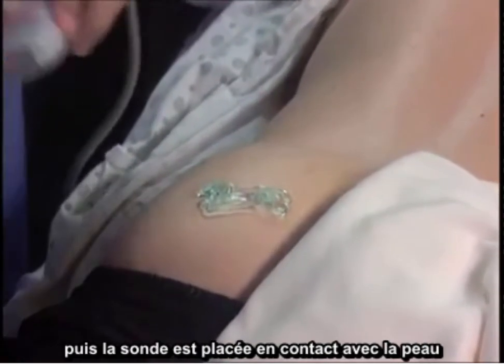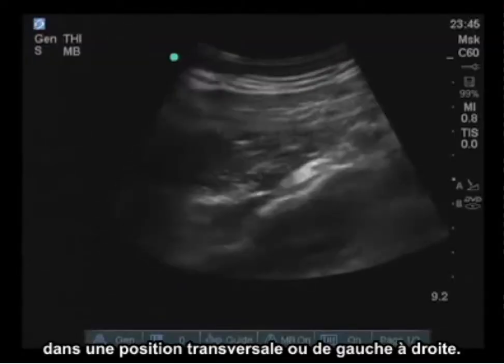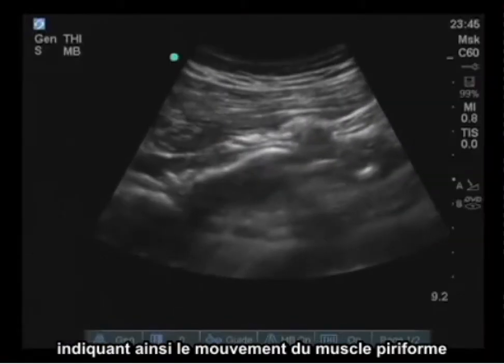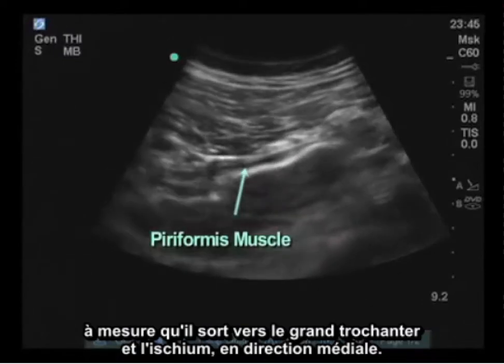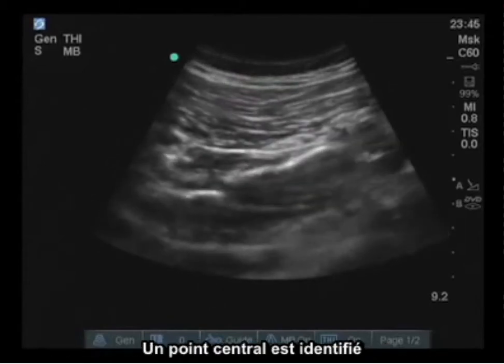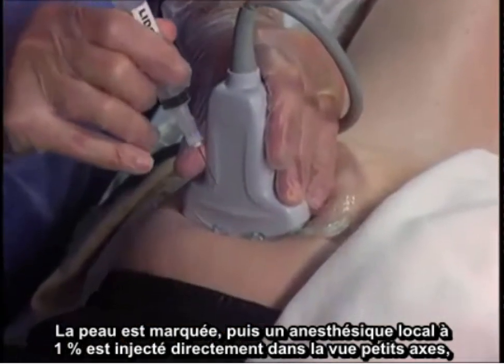The middle portion of the gluteus is identified and then in a transverse or left-to-right positioning, the probe is placed in contact with the skin. The leg in question can be mobilized in an abduction-adduction maneuver demonstrating motion of the piriformis muscle as it inserts out towards the greater trochanter and towards the ischium centrally. You can also identify the sciatic nerve as it passes very close to the fibers of the piriformis muscle. A central point is identified, making sure to stay away from the investing fascia around the sciatic nerve.